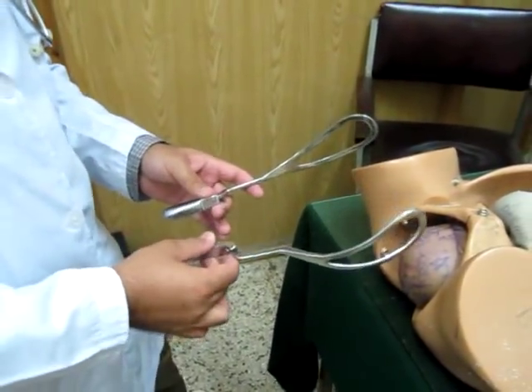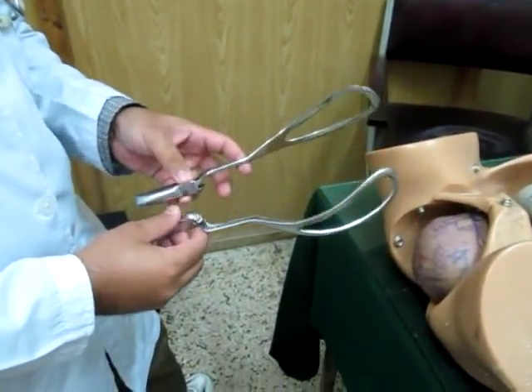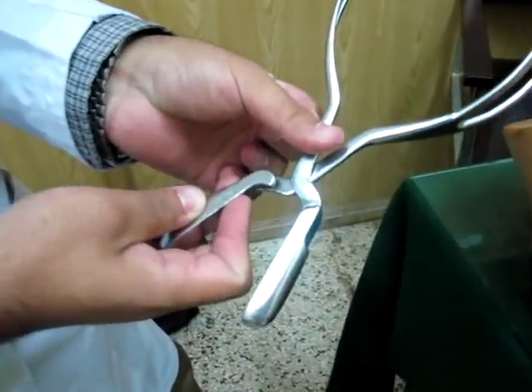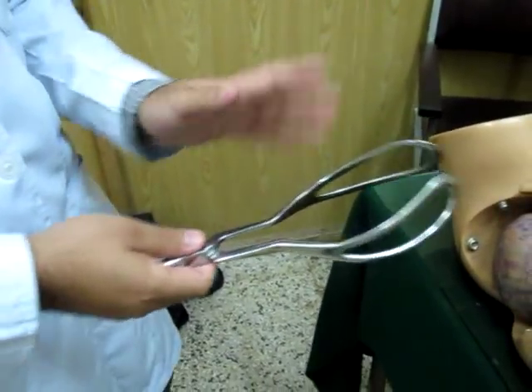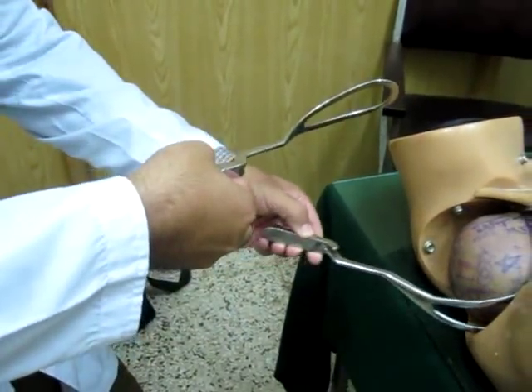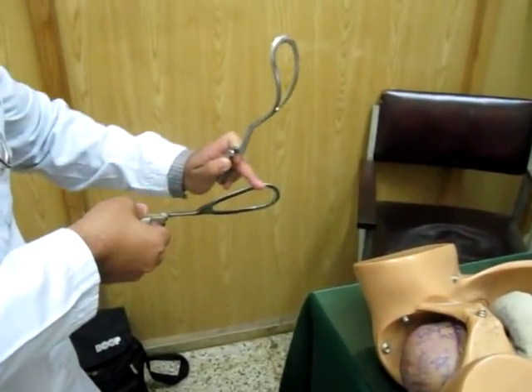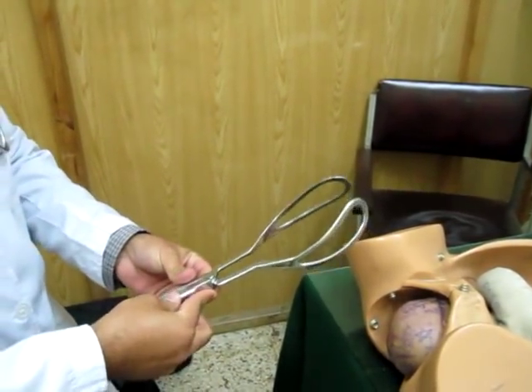Now I have the blades in different hands. When I bring them together like this, it automatically locks itself and tells me which one to insert on the left side and which one on the right. All you have to do is keep the dip above, hold them together, and lock them. This is the locking mechanism.